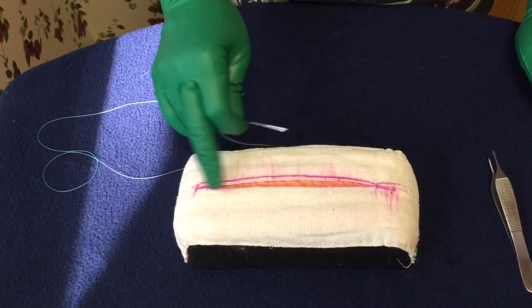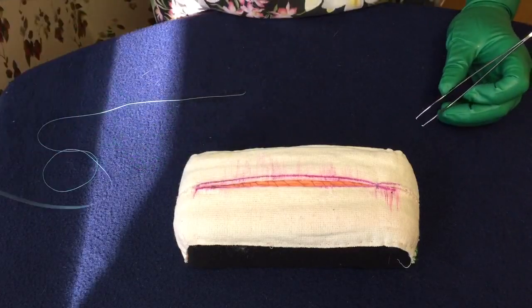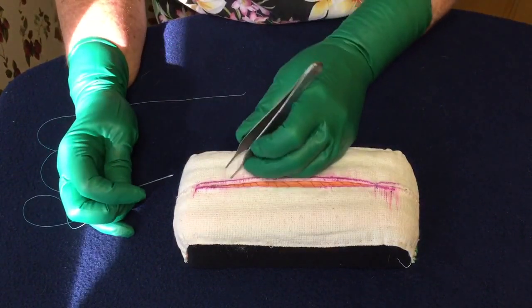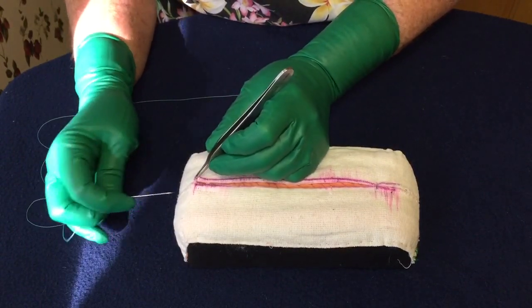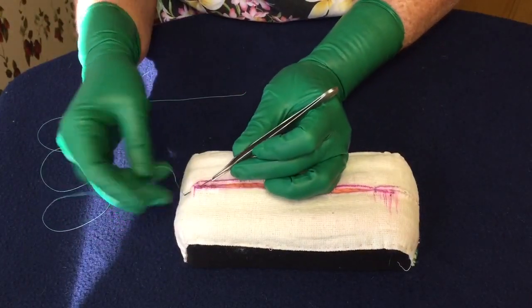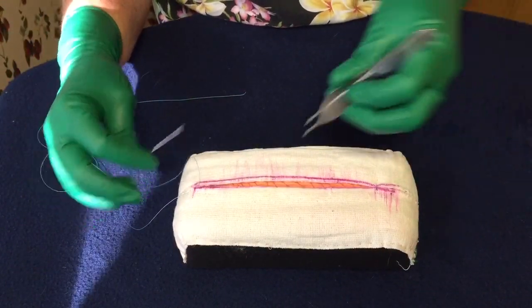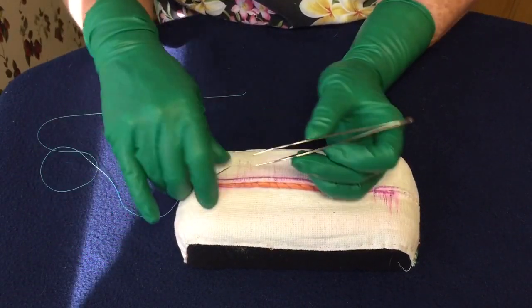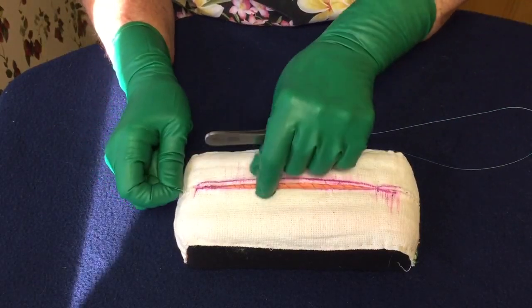I've closed the deep dermals here to try to mimic what the skin would be like if you had closed it on an actual person. The first option is the one that I do with the plastic surgeon I work with a lot. We always just go in at the end — you can use this finger to push it with. You go in at the end and then leave that part out, keep the needle in the corners, start doing your stitches, and then leave a little bit out and you can just pull it.